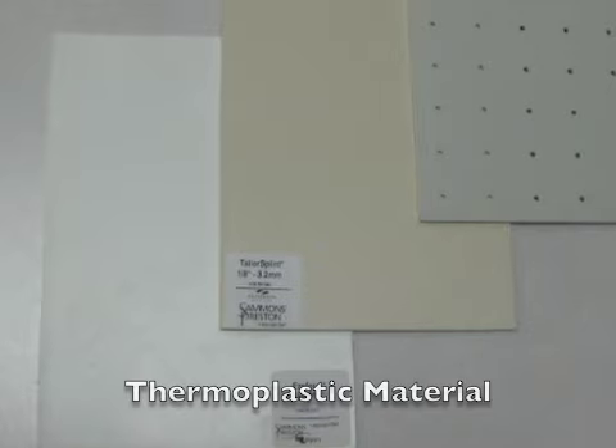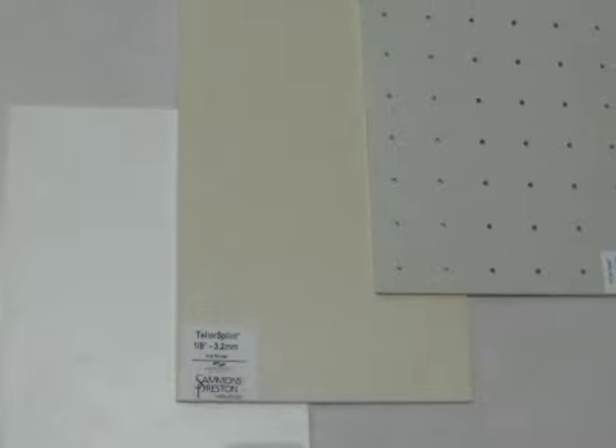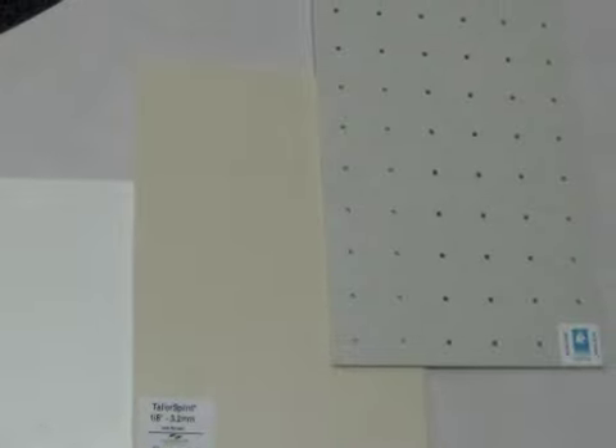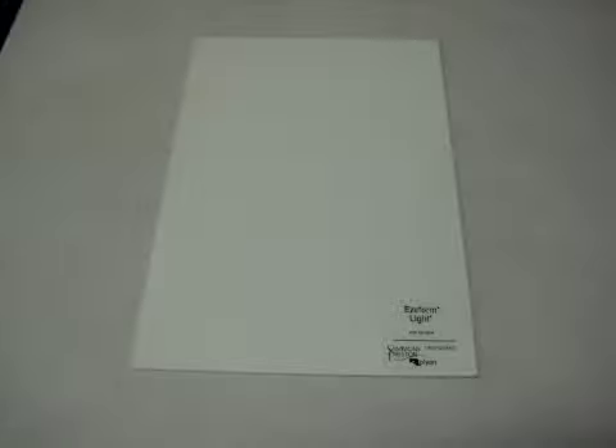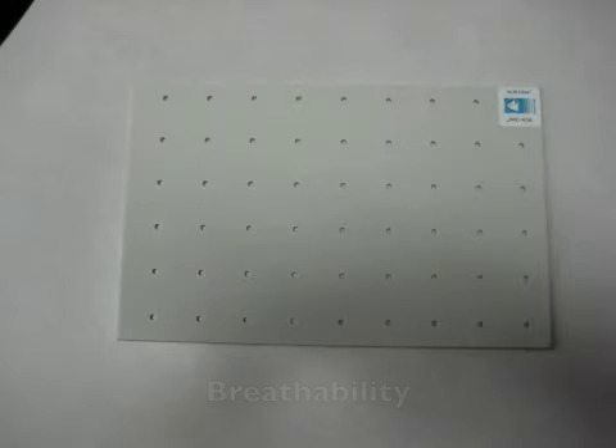The most commonly used material for splint fabrication is thermoplastic material, which can be softened for molding by placing in water heated between 135 and 180 degrees. There are many properties to consider when selecting material, such as resistance to stretch, which refers to the elasticity of the material's tendency to return to its original shape; drapability, or the amount of ease with which the material conforms to the underlying surface without manual assistance; bondability, or the degree to which the material will stick to itself when heated; working time after being removed from the water; breathability, which can be enhanced with perforations; and strength.